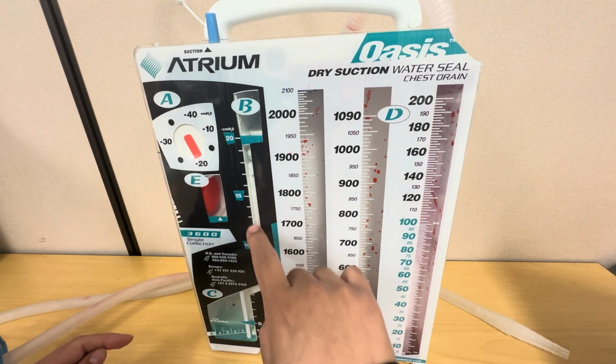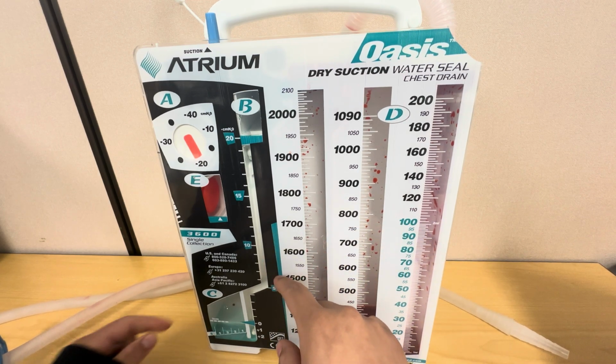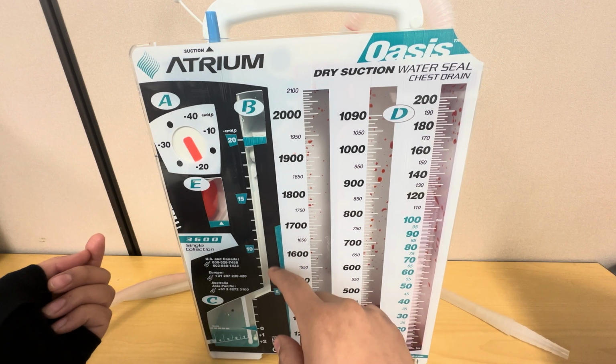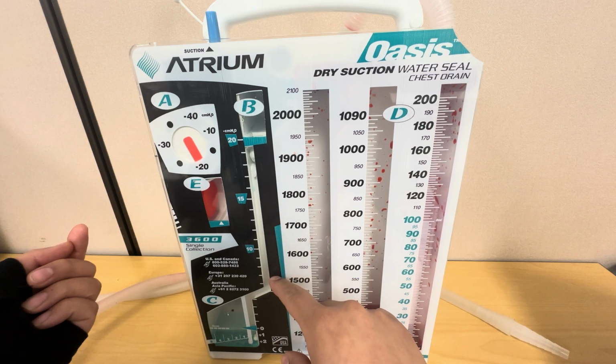So here in section B, we have what's called a water sealed chamber. So what we want to see here is tidaling. This is what we'll usually see when patients are removing air from the pleural space. So with each inhalation it'll go up, and with each exhalation it'll go down.